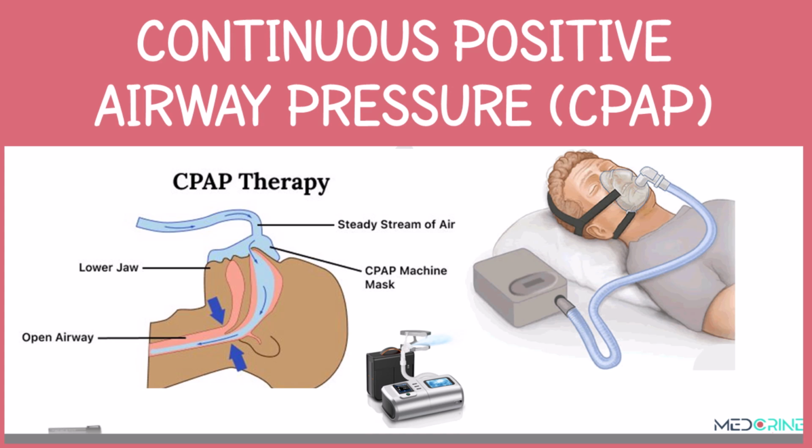Welcome. Today we shall be looking at continuous positive airway pressure, or CPAP. CPAP is a crucial non-invasive respiratory support technique that is widely used in neonatal, pediatric, and adult care settings. By the end of this tutorial, you will understand its physiological basis, the clinical application, setup, and potential complications of CPAP.